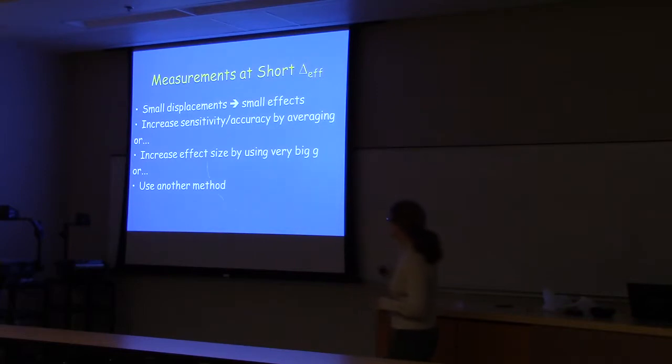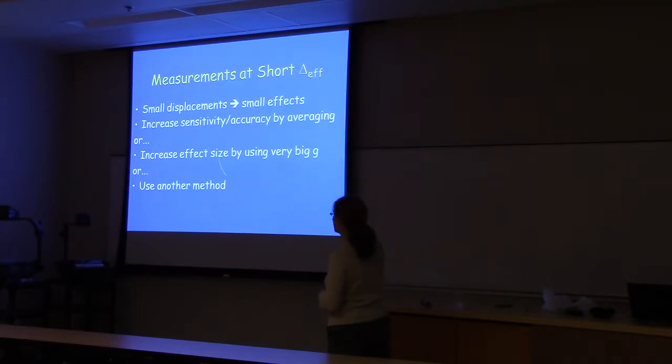From people who really take diffusion sequences and push them, I've heard my friends complaining their skin starts twitching. Some of them actually felt pain. And there was a really wacky study done in the UK. They must have different ethics than we do. They actually put people in the magnet and kept increasing the gradients. And, okay, tell me when it hurts. And that's what they're really basing the limits of how fast these things can change.